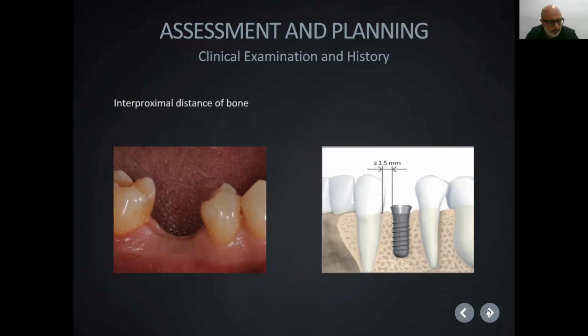Just looking at this year's success rate, we're at around 98%, which is in line with what it should be, between 95 and 98%. But the BLT implant is what I usually recommend, Straumann's BLT implant, for people beginning, and that will take you right up to being intermediate. Some of my colleagues who are more advanced than me still use it, and it's less aggressive, so it tends to go down the hole that you drilled, the osteotomy.